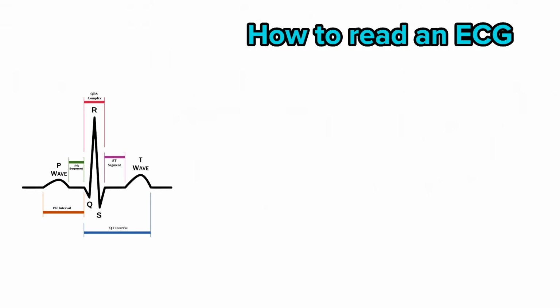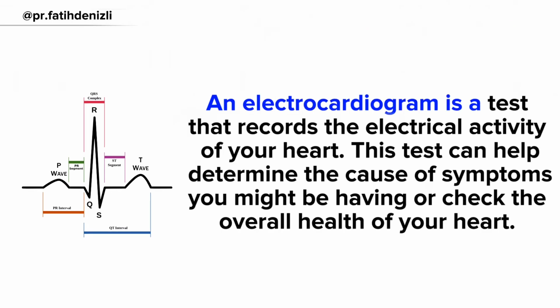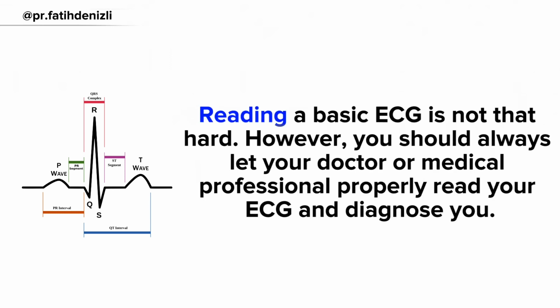How to read an ECG. An electrocardiogram is a test that records the electrical activity of your heart. This test can help determine the cause of symptoms you might be having or check the overall health of your heart. Reading a basic EKG is not that hard. However, you should always let your doctor or medical professional properly read your EKG and diagnose you.